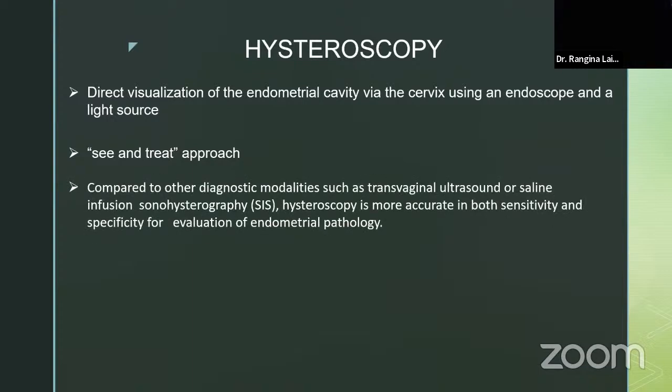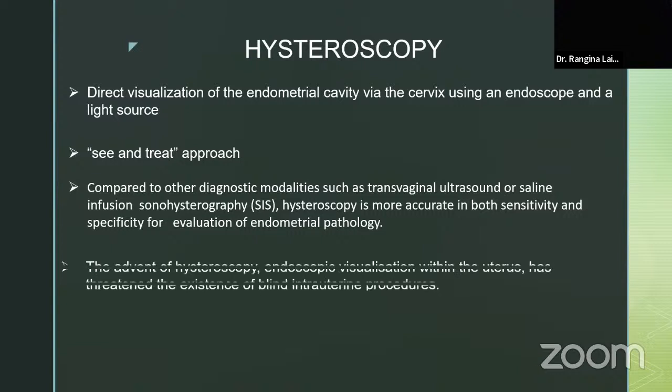Compared to other modalities like transvaginal sonography and SIS, hysteroscopy is more accurate. We all know that to evaluate endometrial pathology, it is more accurate, with endoscopic visualization within the uterus.